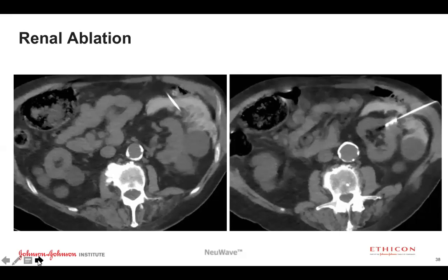Now, look at the trajectory of this needle into the lesion. It looks great, and it worked out great in this case. If I had a different capability to do a different trajectory, I would have, for a couple of reasons. And this is one area where microwave in the kidney is a little bit unique relative to microwave in the liver.